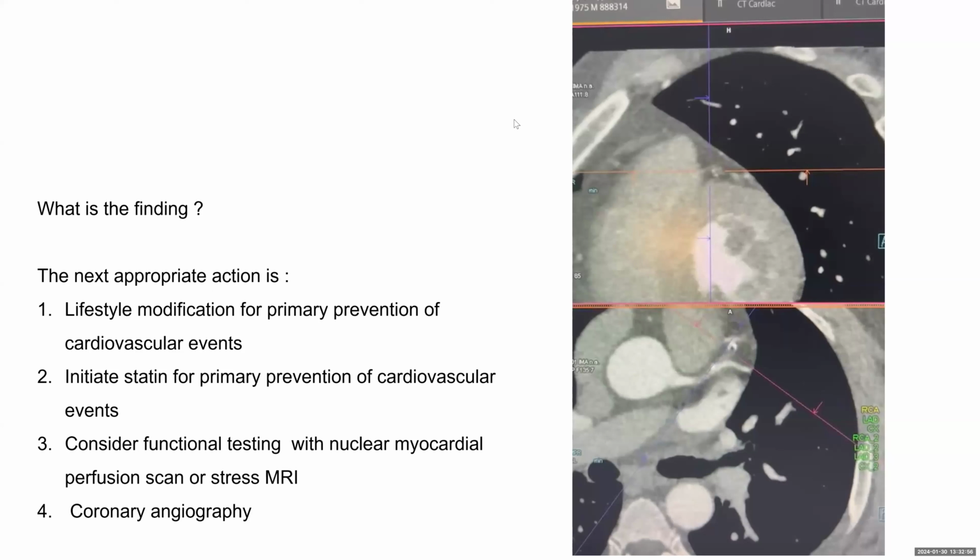All the answers are actually good. Here it comes to your clinical judgment. You could have sent the patient for a perfusion scan if you wanted to really minimize the intervention. But this type of patient, first of all, he's young, he's a smoker, he has chest pain, and there is a clear obstructive lesion in the mid-LAD. So I think ideally we should send the patient for coronary intervention.